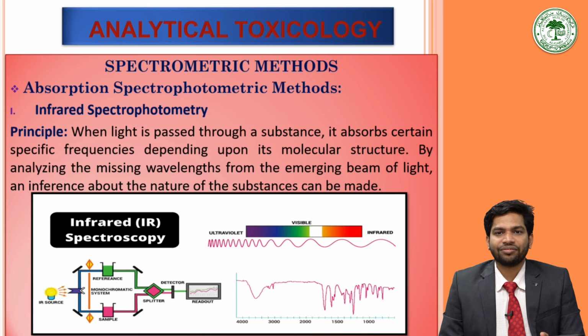The steps for infrared spectrophotometry are that first the sample shall be properly prepared, that is, by pre-treatment, extraction and the cleaning up procedure. Gaseous samples require a sample cell with a long path length to compensate for the diluteness. Liquid samples are sandwiched between two plates of a salt like NaCl, potassium bromide or calcium fluoride. Solid samples can be prepared in a number of ways like the KBr pelleting process. The sample is ground finely with KBr to remove the scattering effect from large crystals.